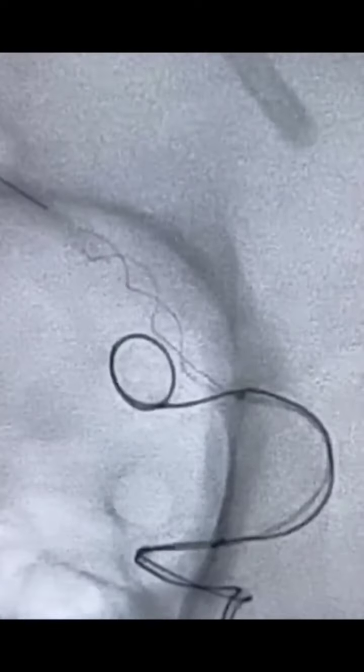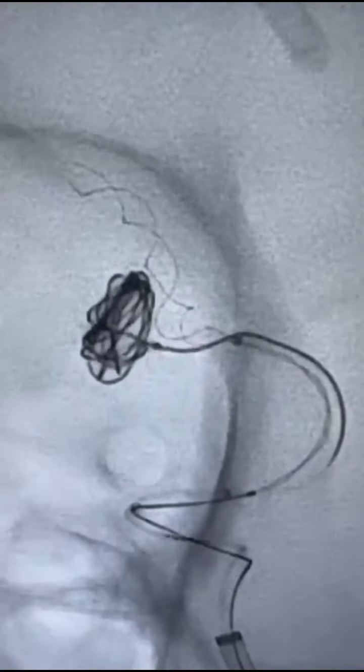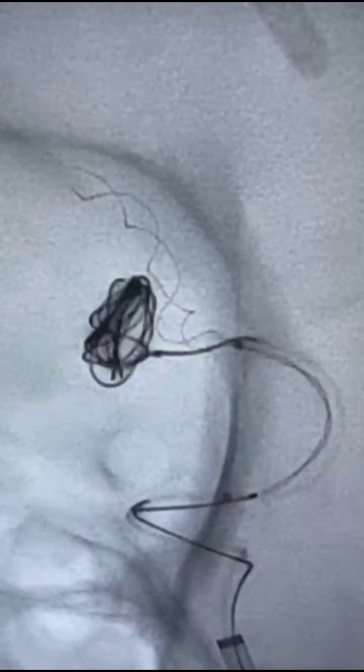Notice the stent being deployed across the neck of the aneurysm. Once the stent is deployed across the neck, a forward push is given to provide an adequate shelf for the coils. Coils were then progressively deployed into the sac, and you note obliteration of the superior lobule.